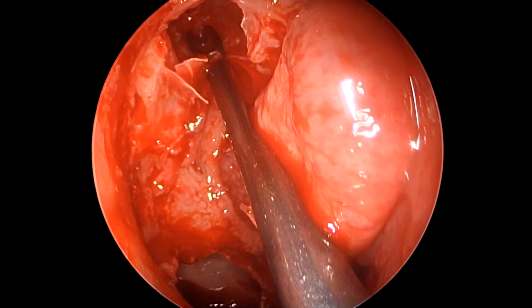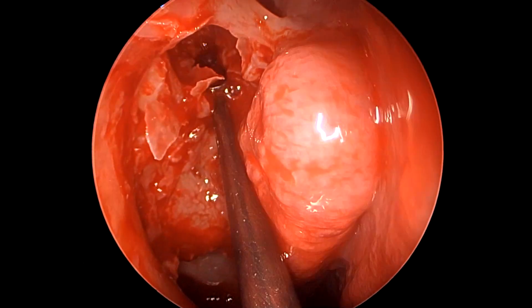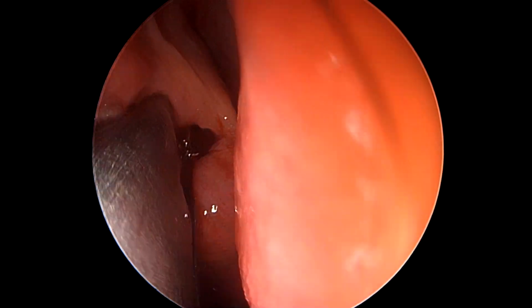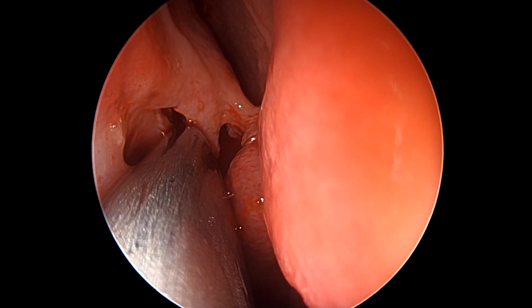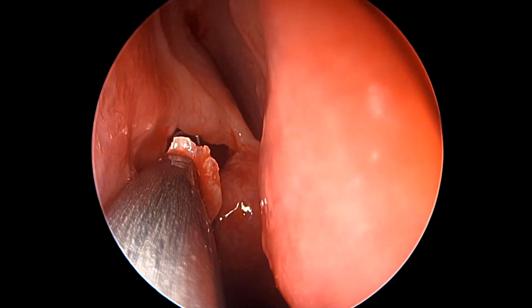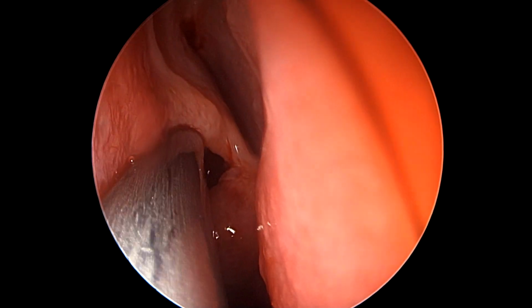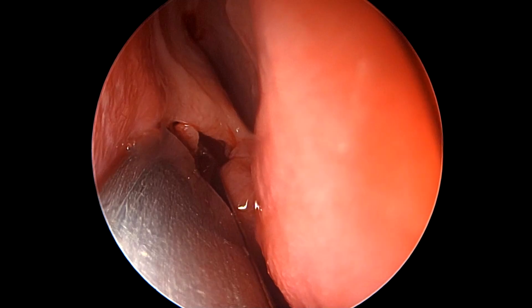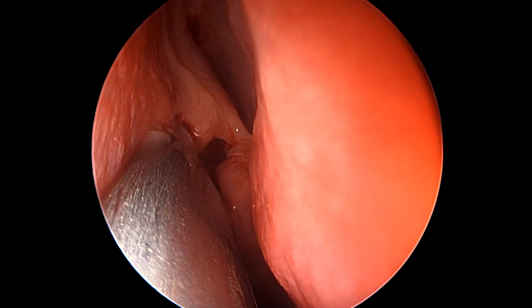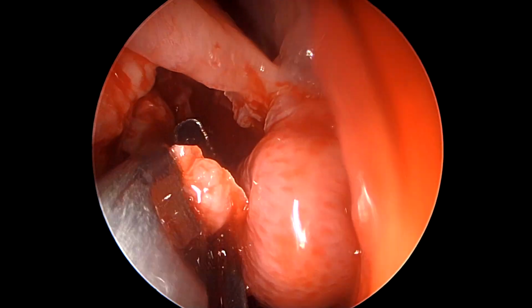As we had already seen, the frontal anatomy here is slightly complicated, with the presence of multiple cells above the agger nasi, with cells reaching high anteriorly, to 50% of the height of the frontal sinus. So we are anticipating already that the opening of the frontal sinus may not be very easy. What we are doing here is using a straight Hajek-Kofler punch to remove the anterior wall of the agger nasi somewhat, so that our working trajectory with the 0-degree endoscope becomes clearer, and we can reserve the angled endoscopes and the angled work for later.